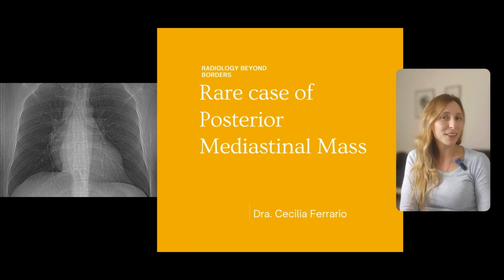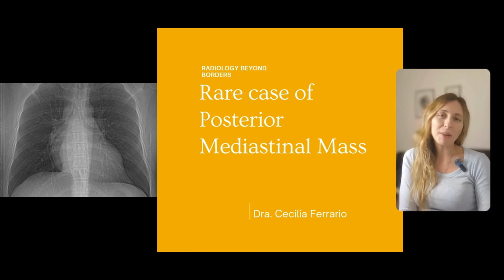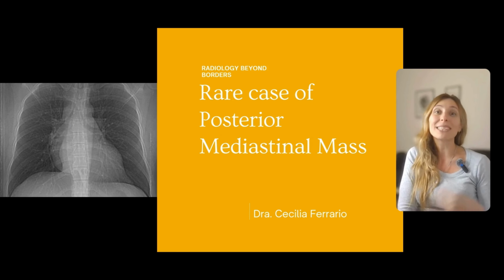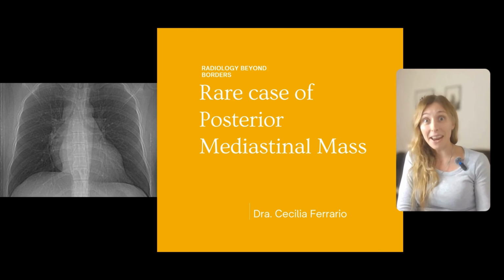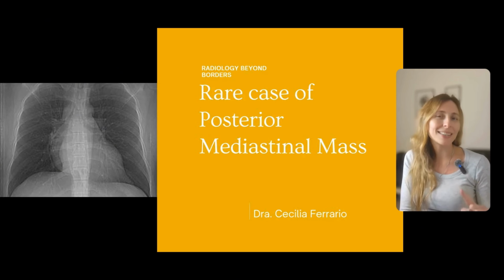I'm a chest radiologist, and as you know, this space is designed for non-native English speakers, doctors in particular, who want to present better cases in English. Today, we are going through a rare and fascinating case, a posterior mediastinal mass with an unexpected diagnosis.